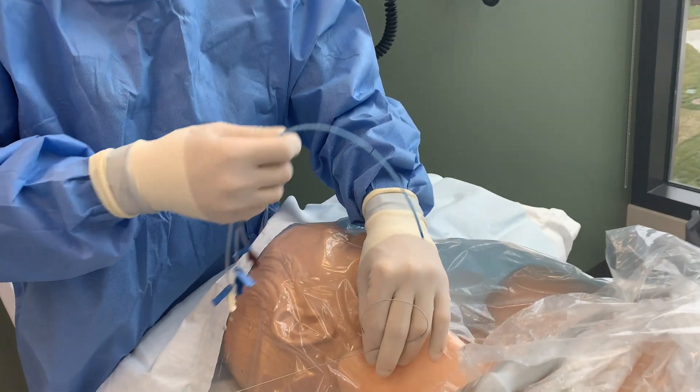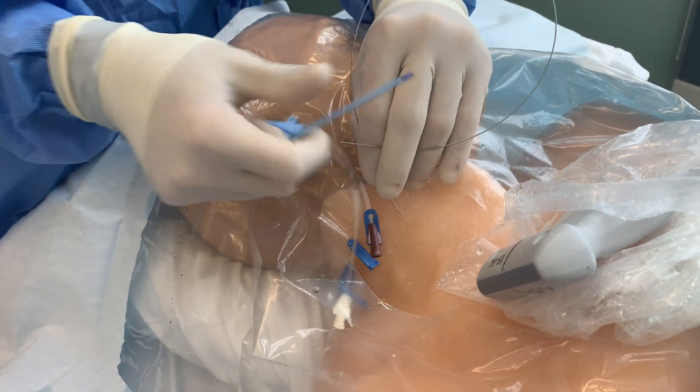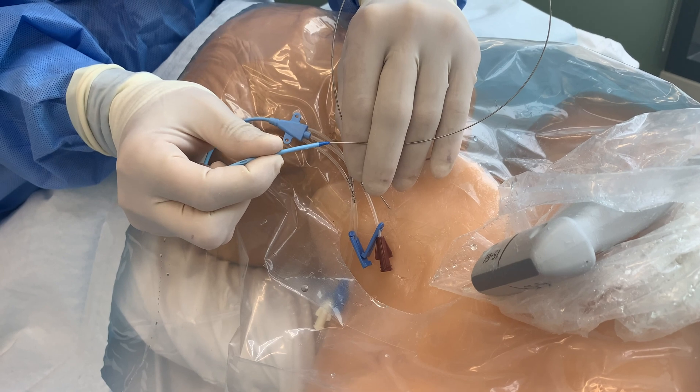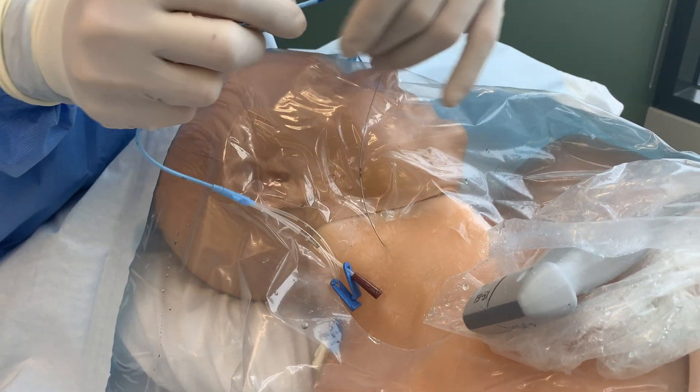At this point, you are ready to insert the central line catheter. Begin advancing the catheter over the guide wire to the approximate depth of 15 centimeters, depending on the patient's height. Be sure to continue monitoring for any EKG changes at this time.